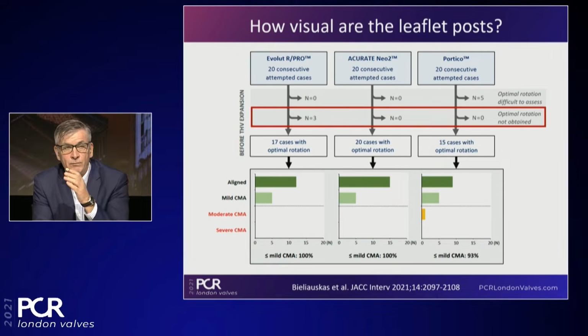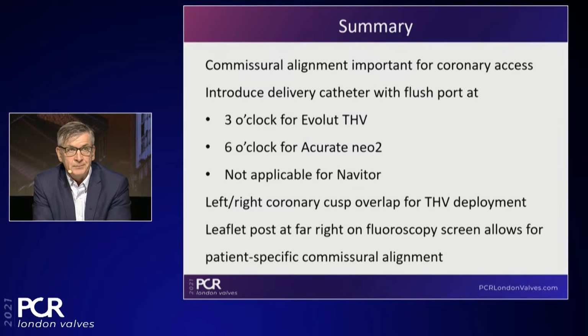And in that way, I think the small study we did here shows that the ACURATE valve is actually the best valve to obtain commissural alignment.